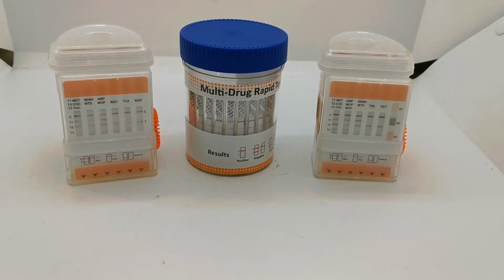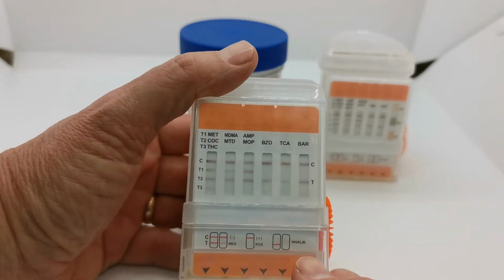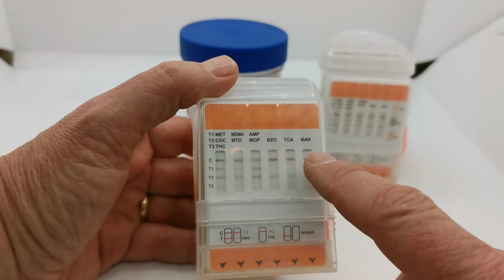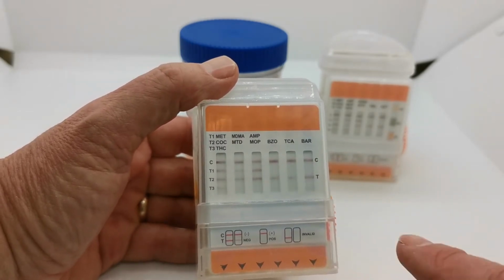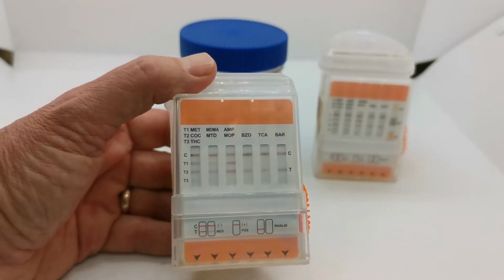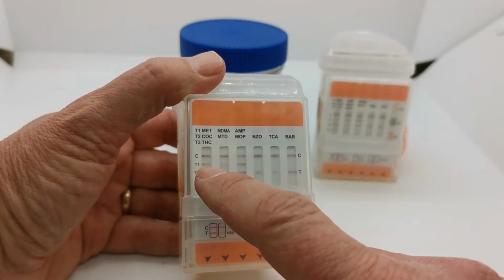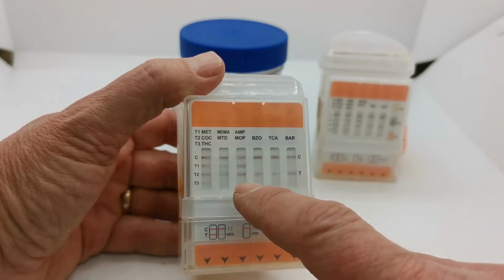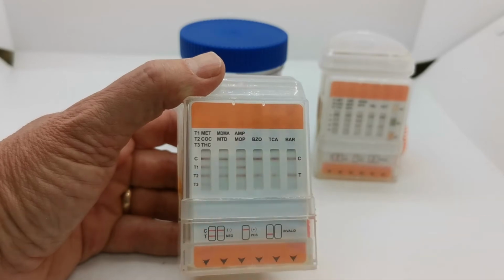Now let's show you some of these test results to indicate what we are discussing here. Let's take this example. We've got control lines across all the membranes that have been run on this test, but just look at the difference in colour density, saturation and thickness. Example here is between the T3 and the control line, or the T3 and the T2 line for this test. Very different colour densities and saturations.